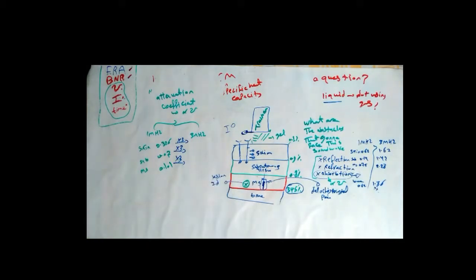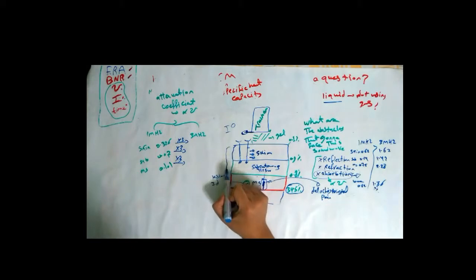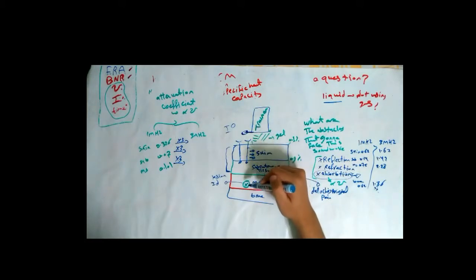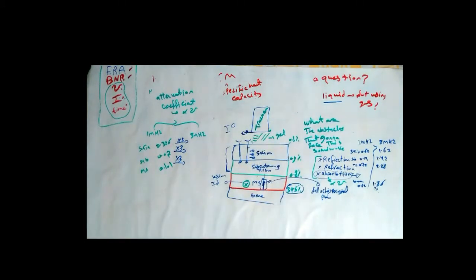So I have to know how much the medium between the transducer and the target tissue will absorb of energy. And to get this, we use this equation.